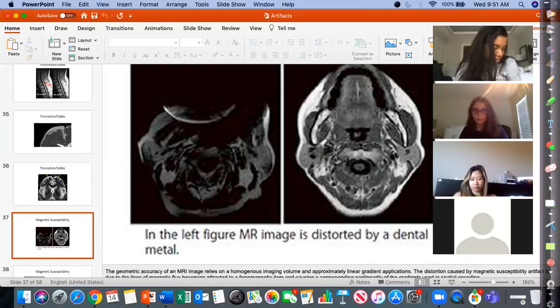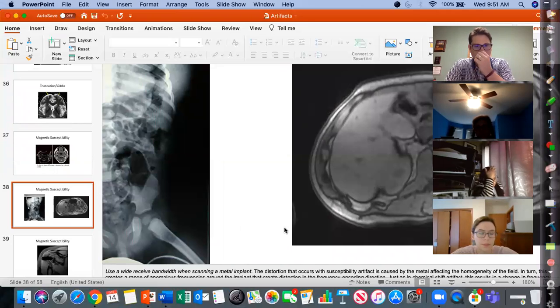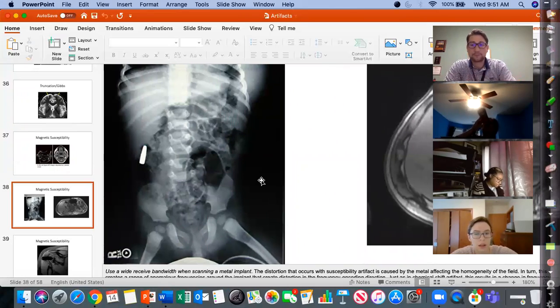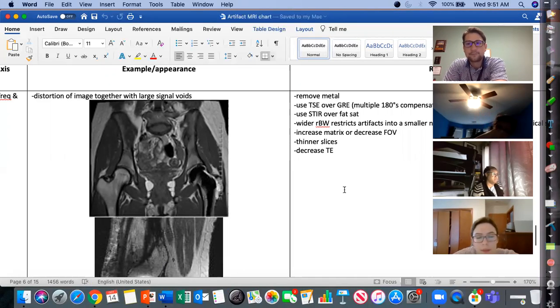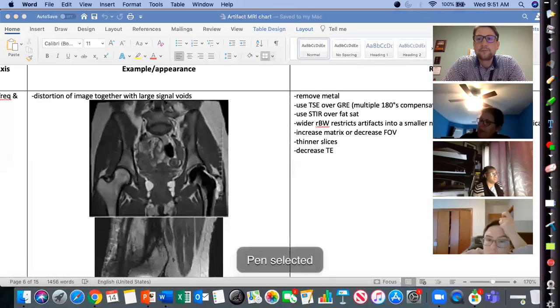I have a quick question. Yep, go ahead. So with a turbo spin echo, when you're thinking about a Siemens, we have a turbo factor that we can change. I just don't want to get them mixed up, or I want to make sure I understand it correctly. So I was asking about it.